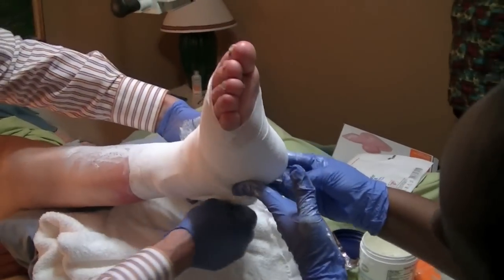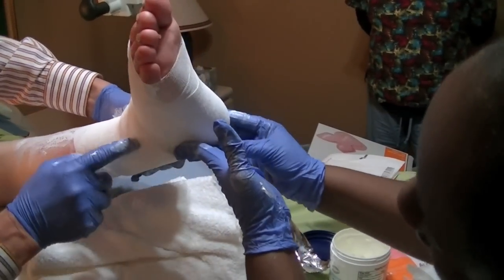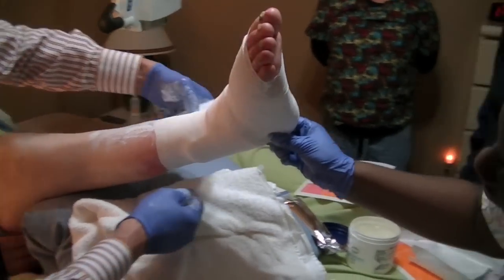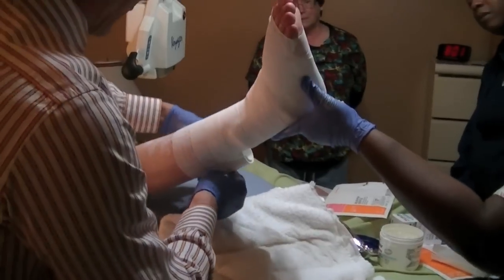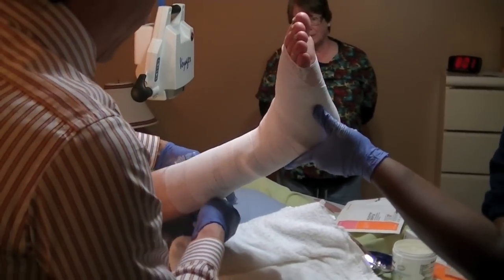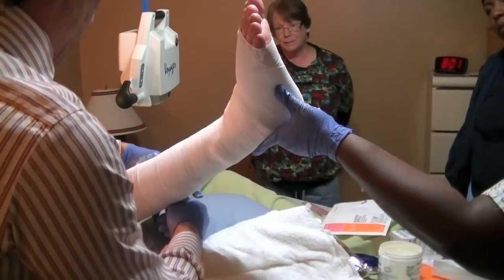Once you have it in place, then you can start wrapping. You can see how in between the wraps here it's small — we're going to get larger as we go up. That provides a graded compression so that compression is more effective at the bottom and continues to go up.